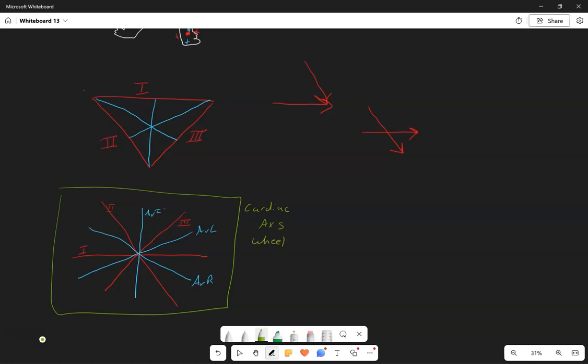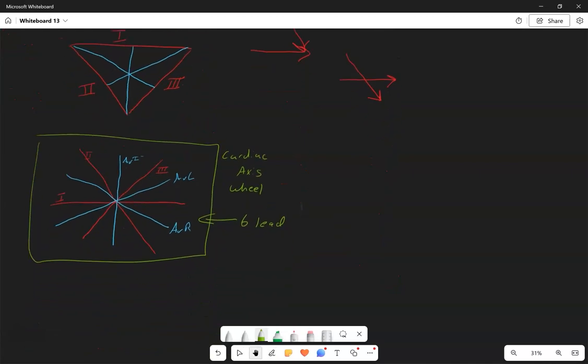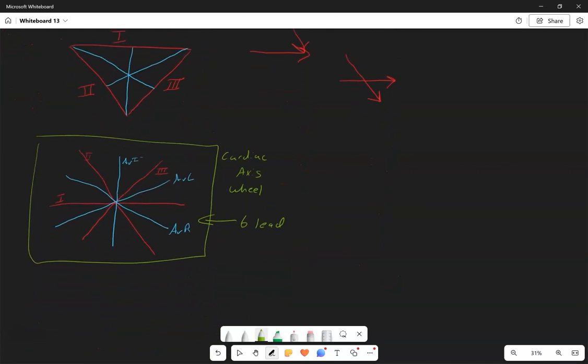And what we can do is we can look at the overall readout from each one of the leads, and we can determine what is the overall direction of the electrical current. Now, notice that there are 6 leads. This is what we call a 6-lead ECG or EKG. Okay, but notice, up here, that it only gives us the coronal plane, right? Left and right, up and down. That's all it gives us. Same thing with our AVL, AVF, and AVR. Left and right, up and down. Okay, if we want to measure front and back, or anterior, posterior, we have to change this into what we call a 12-lead ECG. But we're not going to do that. We'll leave that for another time.